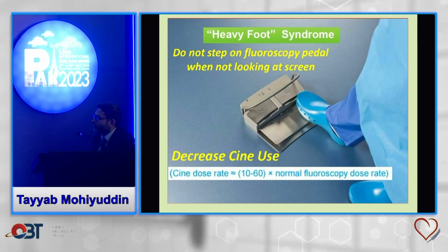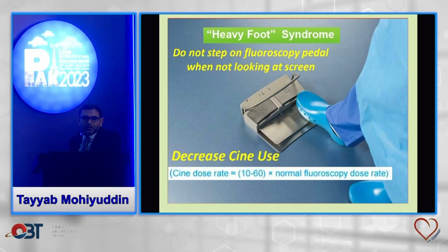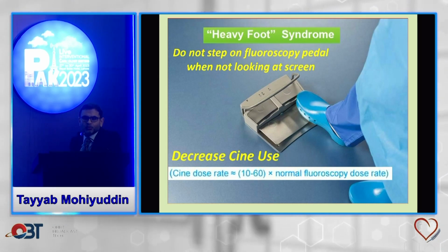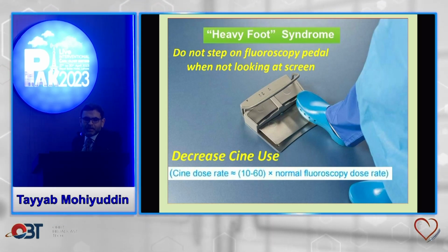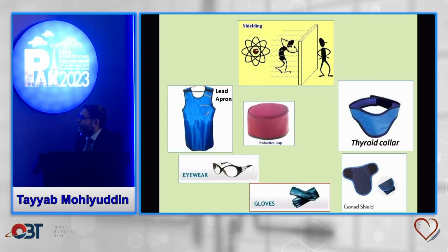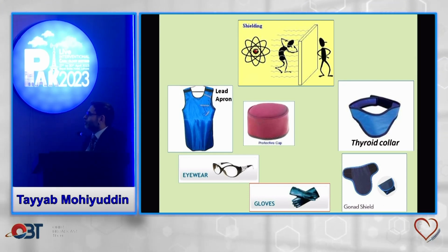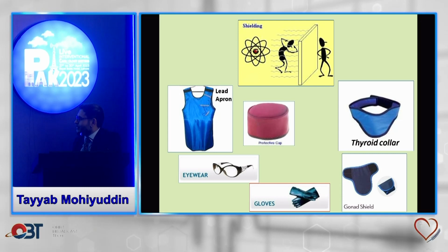Again, heavy foot syndrome, all of us are familiar with it. You really have to let go of the cine angiogram. Where you don't need it, you just do last image hold or fluoroscopy save. Most of the machines have that. Just pressing it for a longer period of time while the balloon is moving does not make it any better.